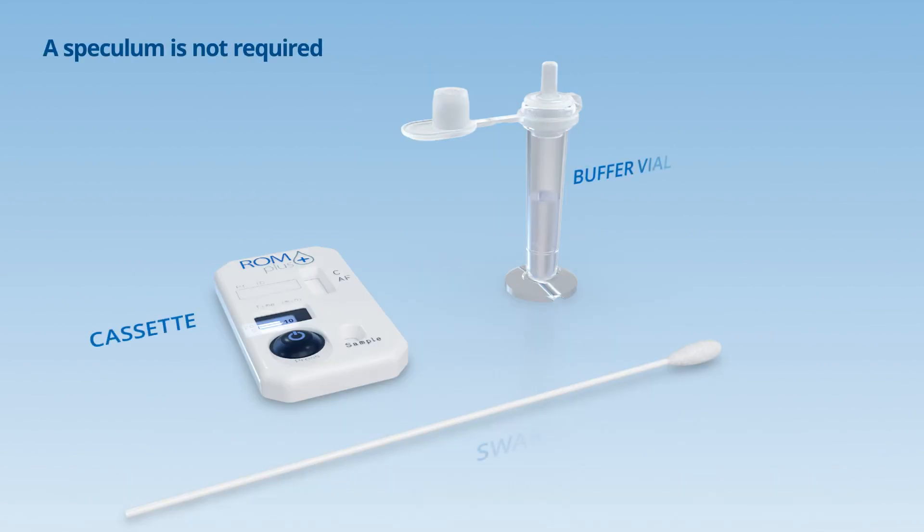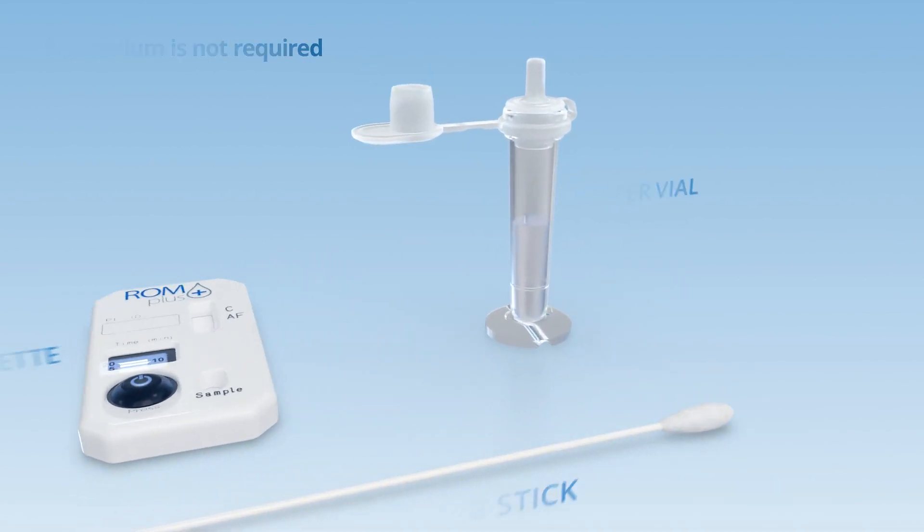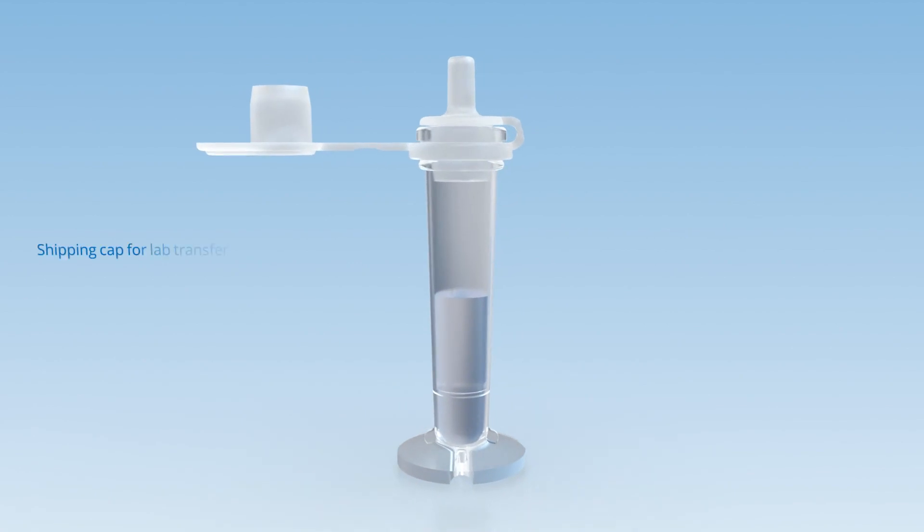ROM Plus is conveniently packaged with everything you need and can be easily run at the point of care or in the laboratory.